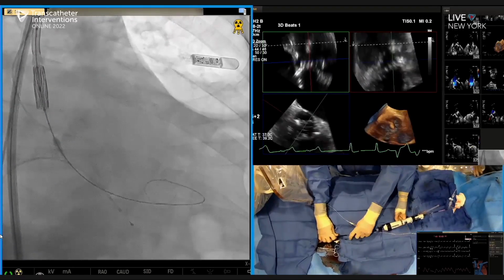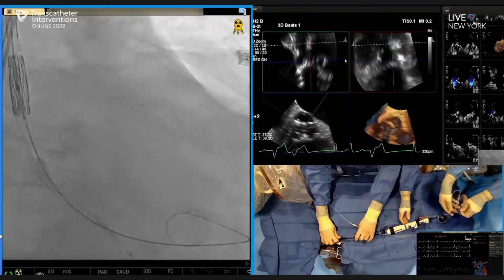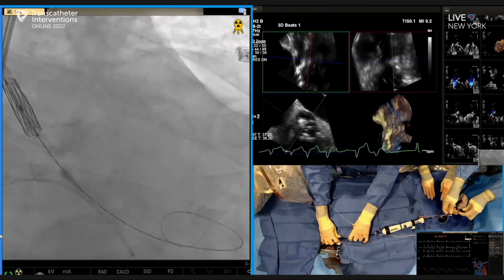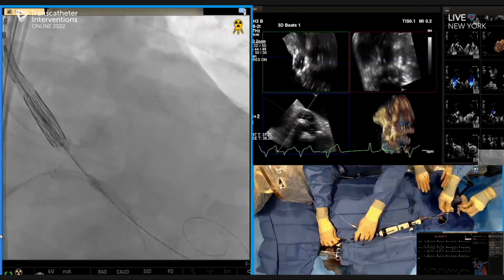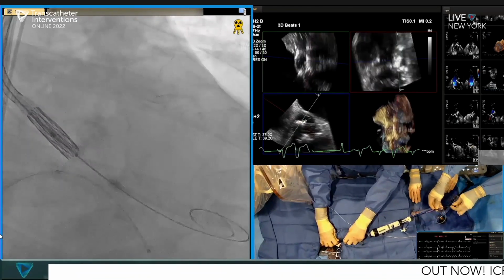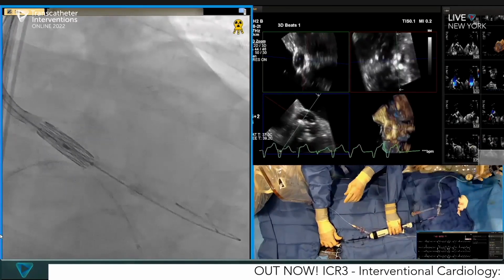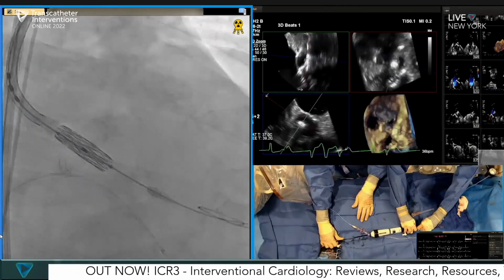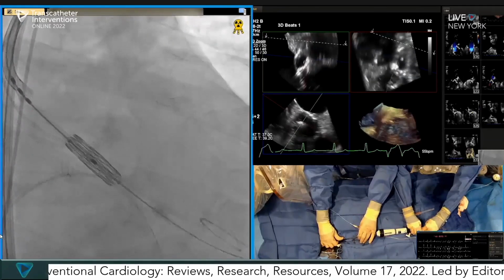Yeah, I mean, luckily the aortomitral curtain tends to move out of the way and there's enough of a cushion around the annulus. But in theory, we early on have wondered if a balloon expandable valve, for instance, would give us ever trouble with that. And if you stent the vessel up front, can you perhaps interact with that stent in a meaningful way? But like you said, we've done about a handful of cases now, not 100, but we've never seen any problem like that in those cases we've done.